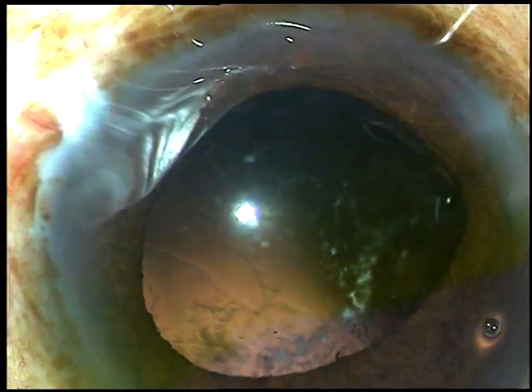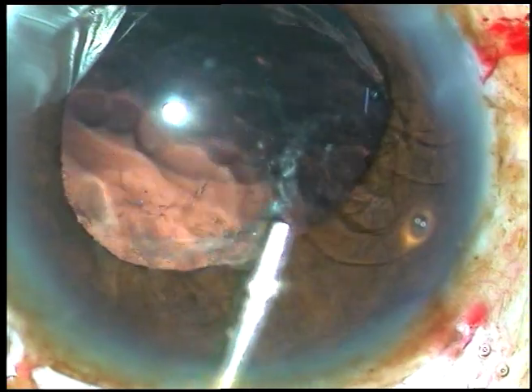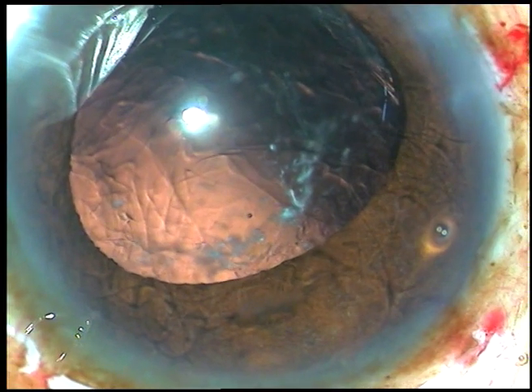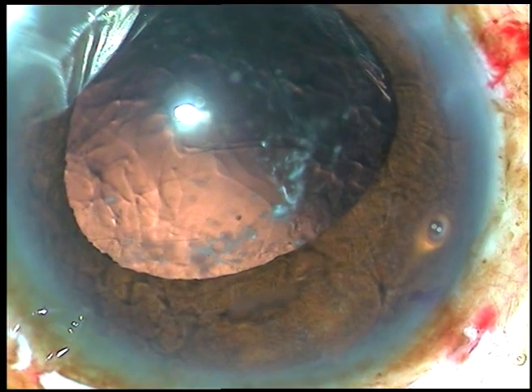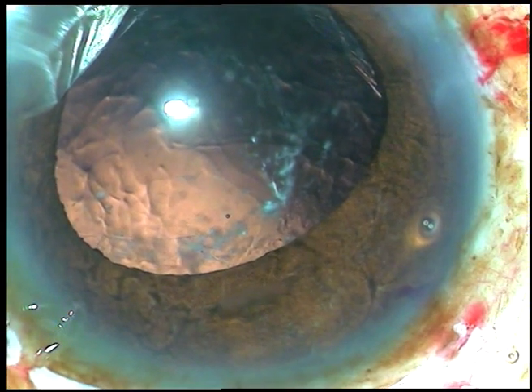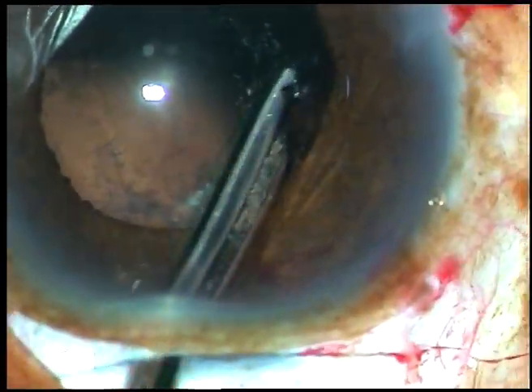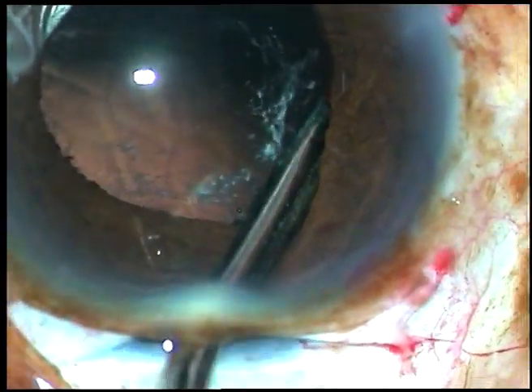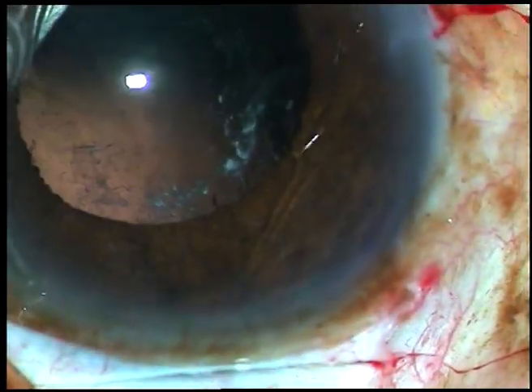Now to go through the main incision, we must inject viscoelastic substance to keep the anterior chamber formed. Because this is a tunnel with premature entry, the anterior chamber will not be formed nicely unless we apply some viscoelastic substance. So cortical clean up is done.